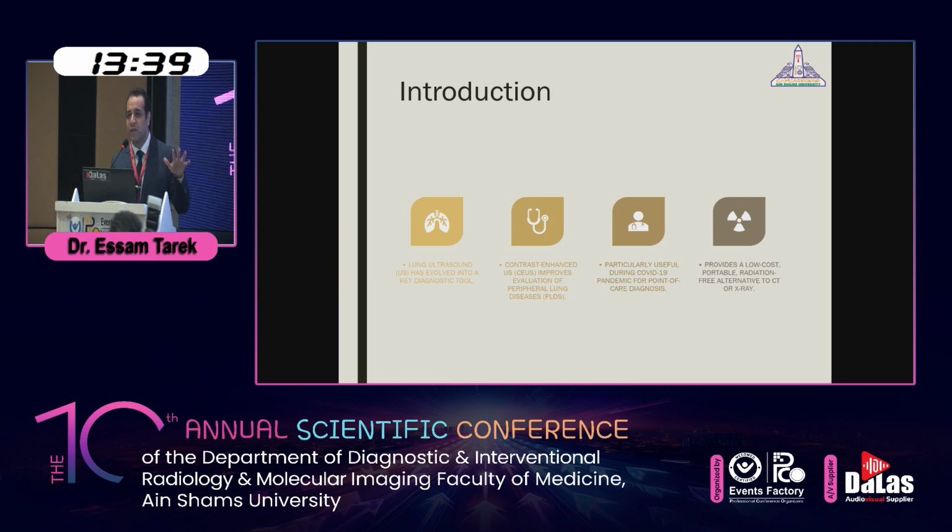Here is one of the challenges of ultrasound, which is the difference in acoustic impedance between the air and the lung tissue, which makes it difficult to characterize central or mediastinal lesions. So mainly we concentrate on peripheral lung lesions, which were particularly valuable during COVID-19 especially.